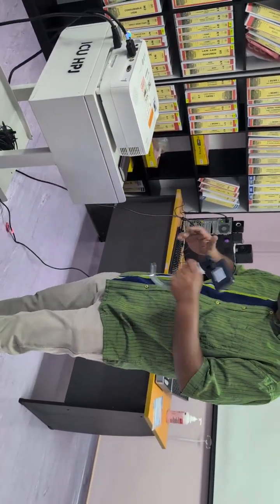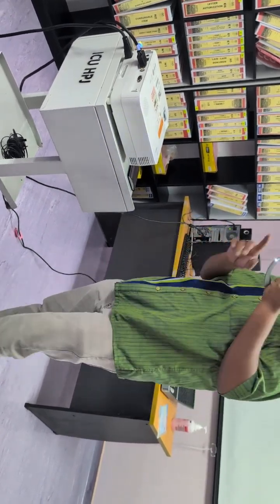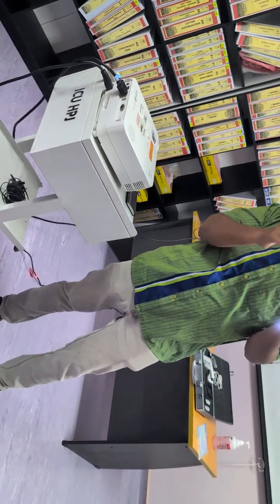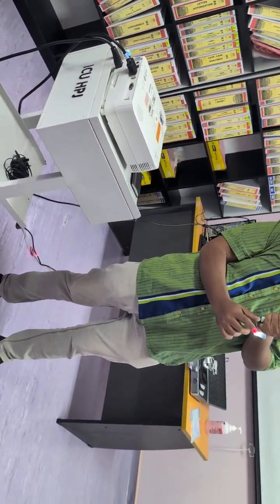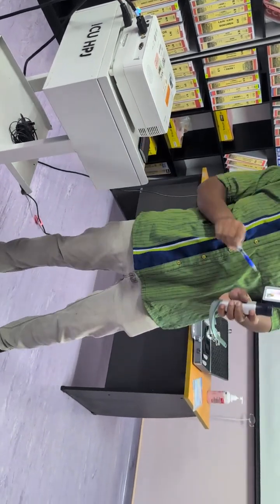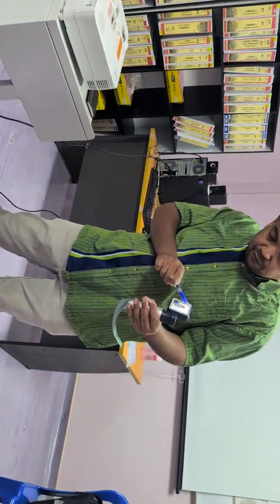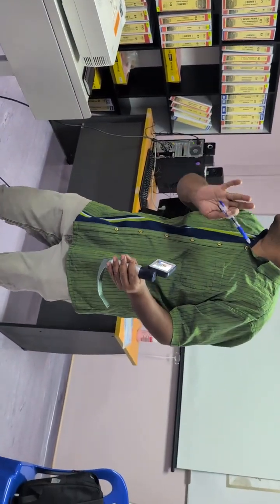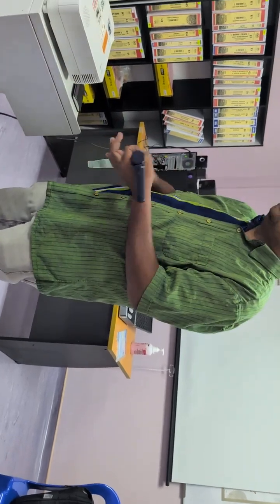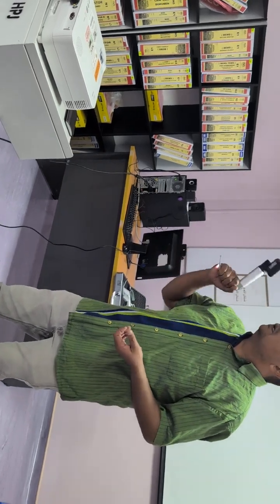It is not like our normal way of intubating, you know. It doesn't work that way because you do not have a direct view, then you're viewing it from here. And the camera is not your eyes level, you know. So that is why when you see the video tadi, the vocal cord is right on top. It is right on top here. Okay, so when you see right on top here, perfect position, you can go in immediately. You know, this is light, not very light as in plastic light.